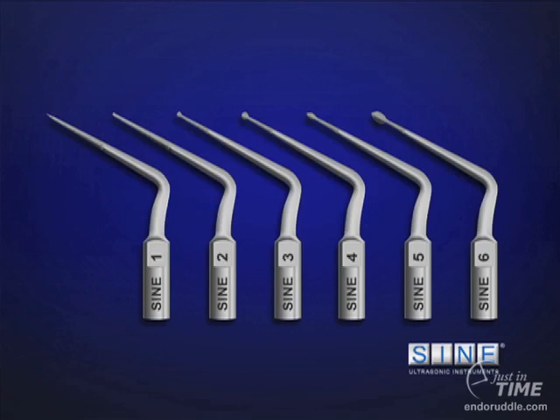These are some sine tips that I've invented. As we know, there's a piezoelectric wave of energy that goes through these insert tips. It's sinusoidal in nature, but the sine 1 tip is pointed, and so that can work in grooves and fissures off of systems, like an MB2 that emanates off an MB1 in a maxillary first molar. The sine 2 has a radius tip that's equivalent to a 35 file, and then we have a sine 3 that has a 0.5 millimeter ball.